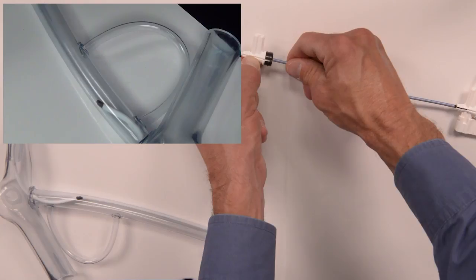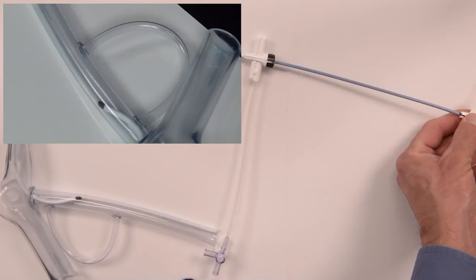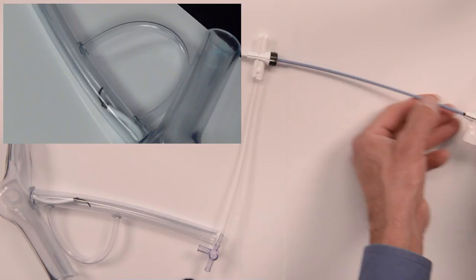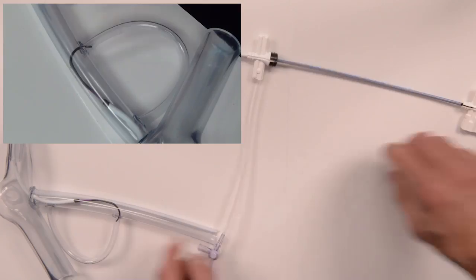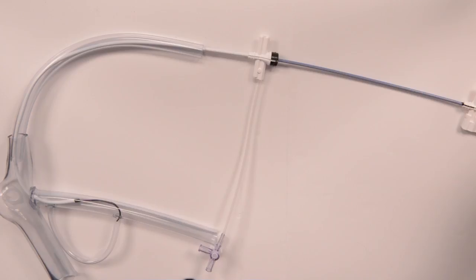To reach this vein, I'm going to use the vein selector. I'm going to advance it—you can see how torqueable this is—advance it maybe past the vessel, torque it, and then pull it back. There it goes, there it engages. Just when I'm engaged there, at this point I'm going to connect the contrast administration kit.